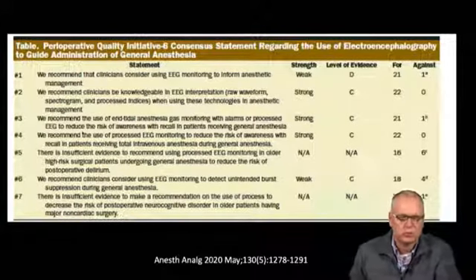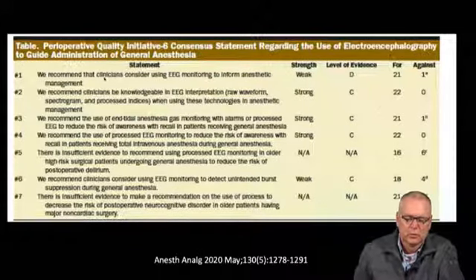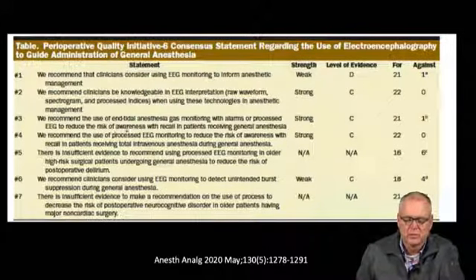And just running through each of these really quickly, we recommend that clinicians consider using EEG monitoring to inform anesthetic management. To be knowledgeable in EEG interpretation, that raw waveform, the spectrogram, processed EEG indices. The use of end-tidal anesthetic gas monitoring with alarms, or processed EEG monitoring, for example, with TIVA, to minimize the risk of awareness.